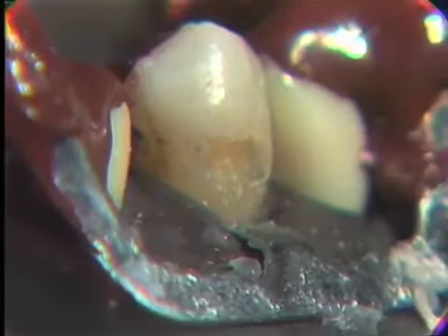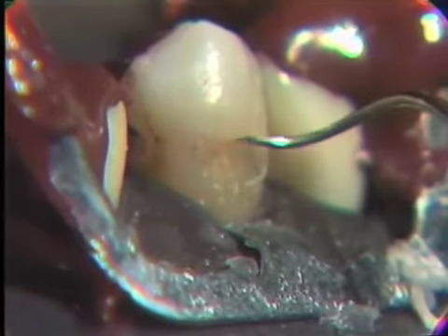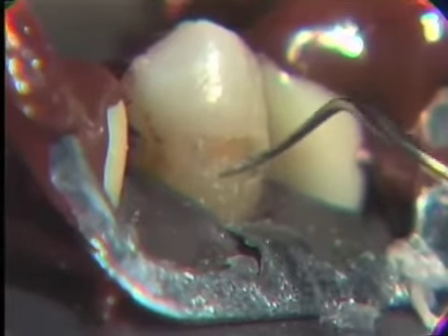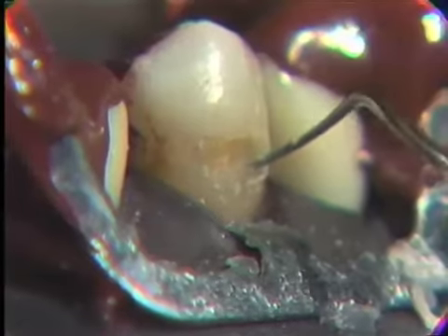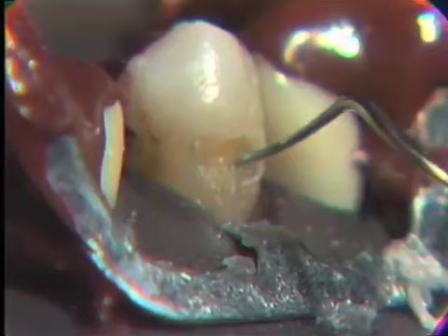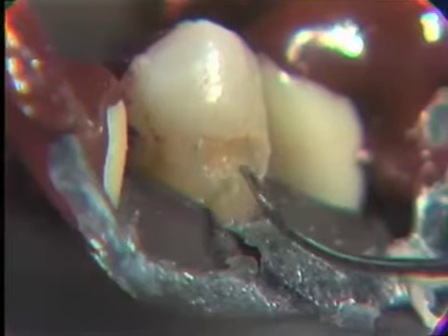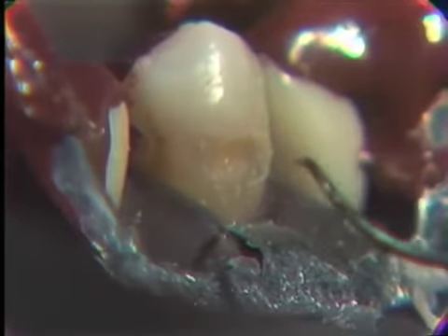On the occlusal margin, at this point, we find some irregularity. Now we're checking the direction of that occlusal wall and the direction of the cervical floor at this point. Our axial wall that we've established has curvature to it. We've maintained some, but it has a degree of roughness and a stepping effect with a bit of decay right over in this area that we will want to remove after we have established the outline form. In other words, we're establishing convenience form, looking into the internal portions of the cavity preparation.